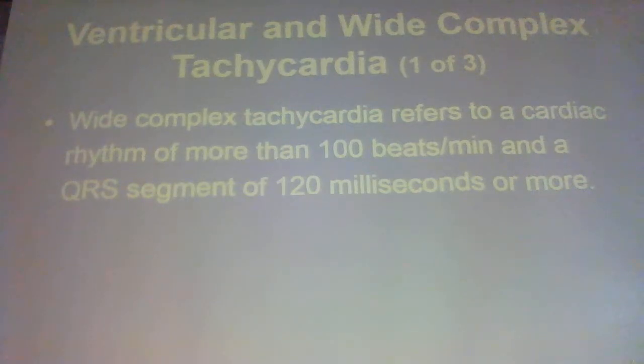Axis. Right, and which axis would indicate VTAC? ERAD, extreme right axis deviation, no man's land. Right? So negative 180 to negative 270. In I and aVF, both will be down. Right? So about that axis deviation stuff, this goes along with your little deal, but just think about this. This is lead I, this is aVF. Normal? Correct? Which one's positive? So that's a left axis deviation.